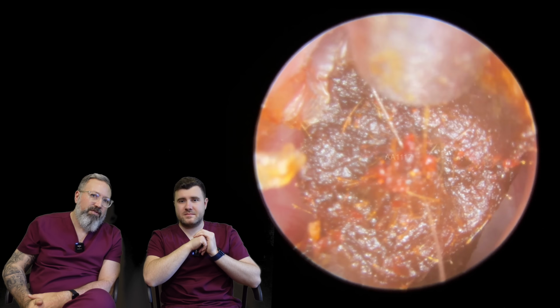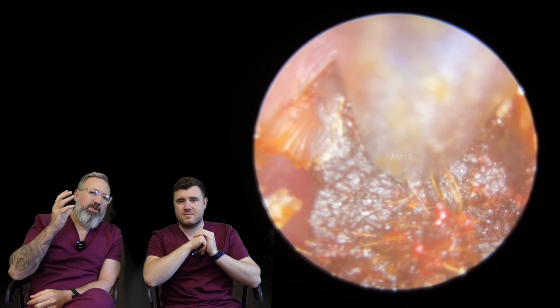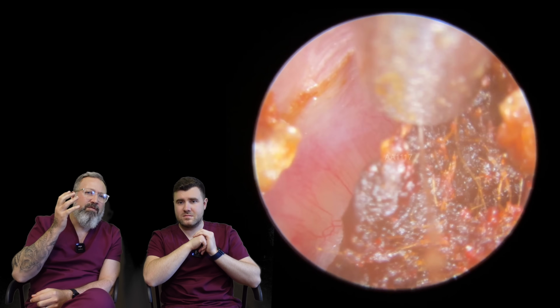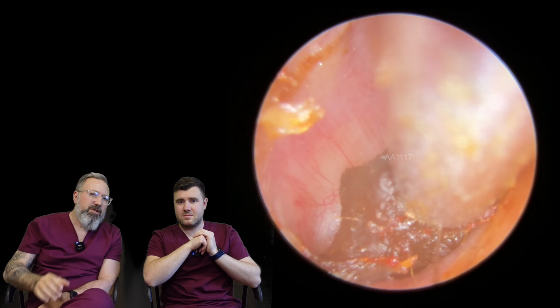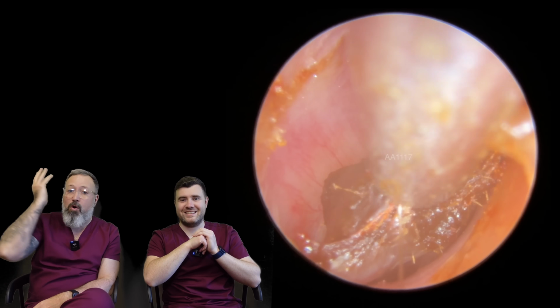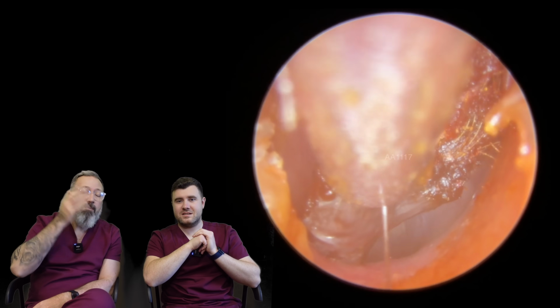You can see just how thick that plug was down near the eardrum. Now, the patient was really struggling with their hearing, getting quite distraught about the fact they were struggling with their hearing. And as soon as I got that moving, oh my goodness, the relief, you could just see it wash over this teenager's face. They just look so much happier. And oh my goodness, I can hear.